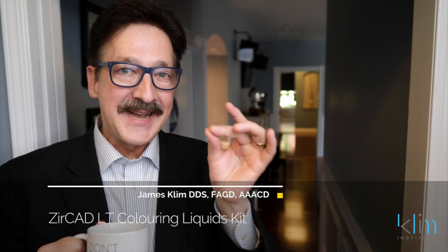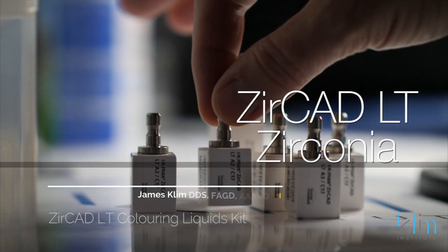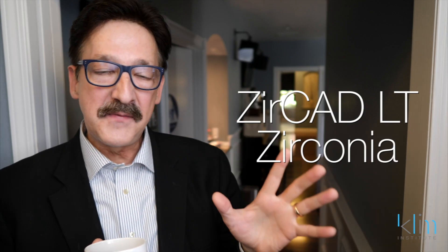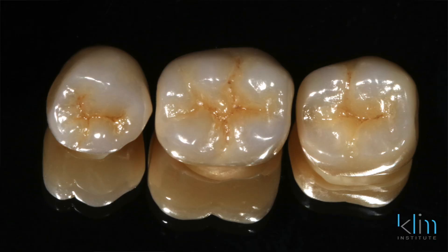When my clinical situation demands a high strength zirconia, I often reach for Zircad LT, but I don't stop there. I want to tone in a multi-effect in the Zircad restoration, and I also want to bring down the value of the cusp tips. That is when I'll reach for the Zircad LT Coloring Liquids.